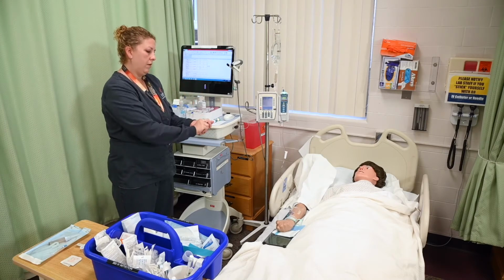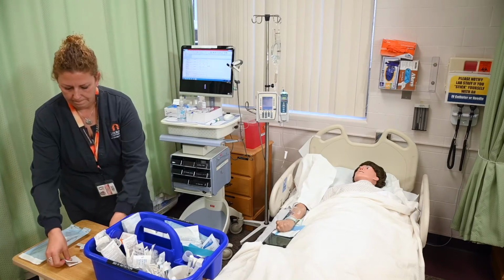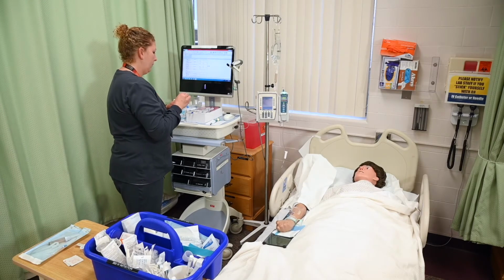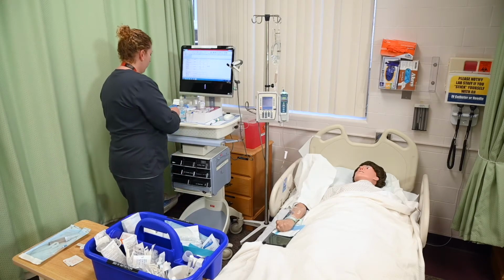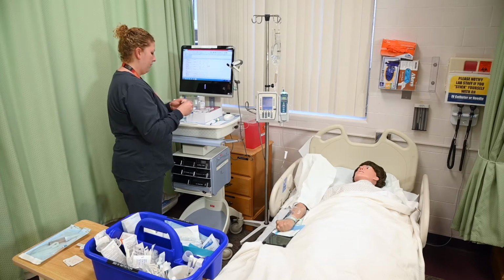Okay. She will disinfect the vial by cleansing the access diaphragm using friction in an alcohol prep pad and then allowing it to dry for at least 15 seconds. I have a 3 ml syringe. She will draw up the medication using aseptic technique.